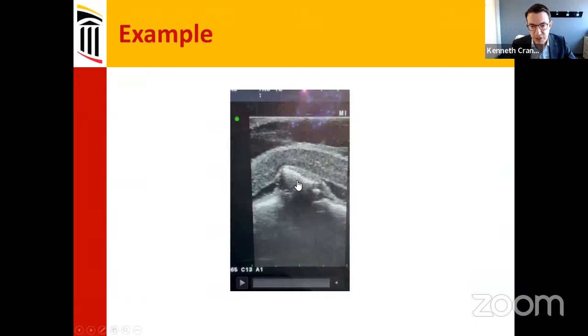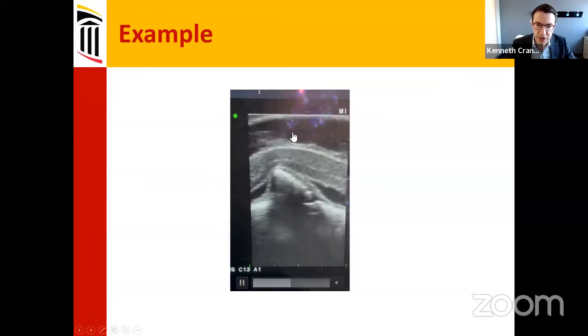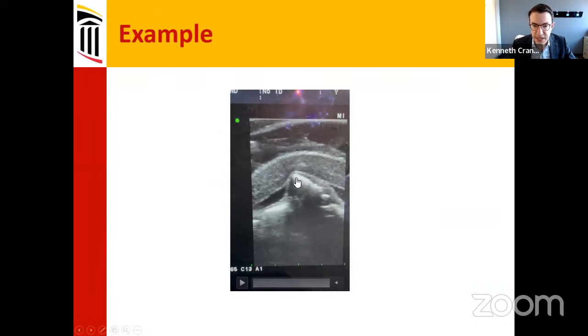I didn't have a video, but it's almost the exact same case, showing this large bony fragment compressing the spinal cord. And you can see, normally you see spinal cord pulsate up and down. You can see the pulsations in the arachnoid above, but the spinal cord itself is very severely compressed and it's not really pulsating at all.